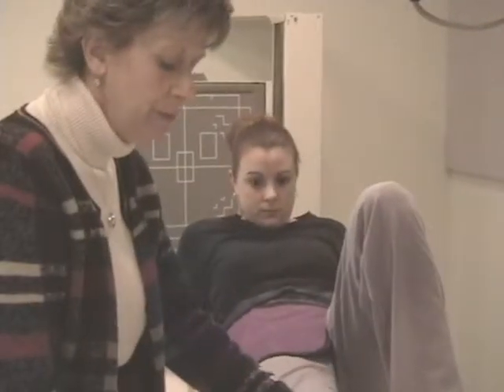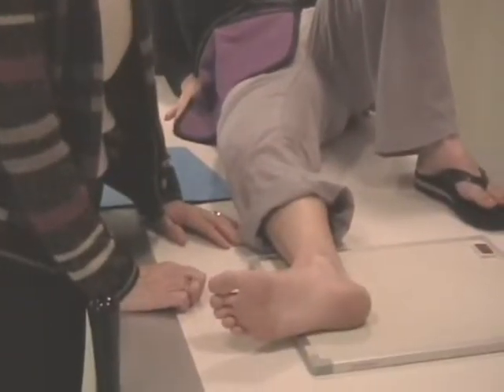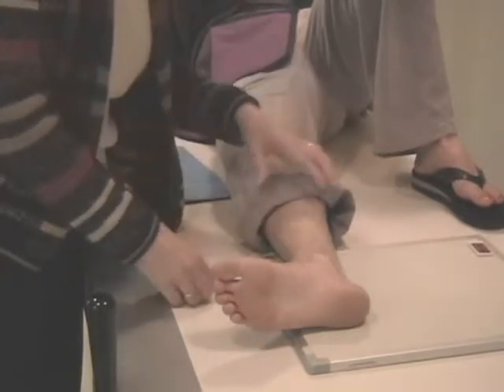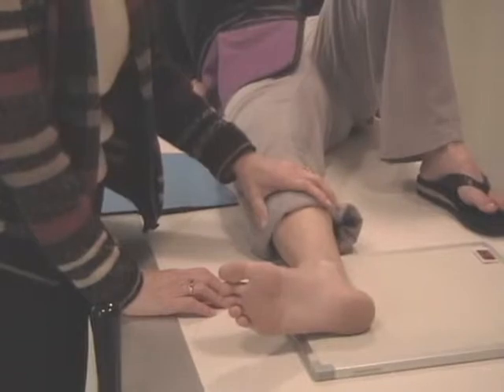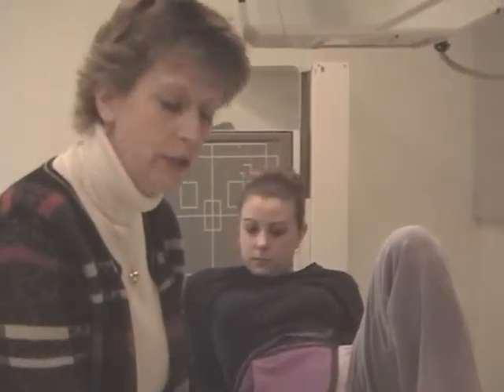And then a lateral is with the intermalleolar line perpendicular. You will feel and superimpose those borders, and they should be one right on top of the other if you've done a good job according to the criteria that we use for our lateral projection.